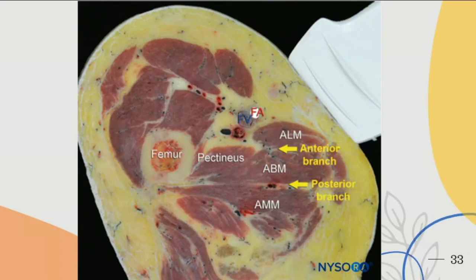I just want to highlight, personally, I've never even considered the proximal approach to the obturator nerve, but when doing the distal approach, you can see in the diagram that your approach is from anterolateral to posteromedial, and you are trying to get your needle in between the adductor longus and brevis, and then in between the adductor brevis and adductor magnus. The problem is that you must plan your needle path correctly, because in your path will be important structures, the femoral artery and vein as well as the femoral nerve. So you have to be mindful of that.